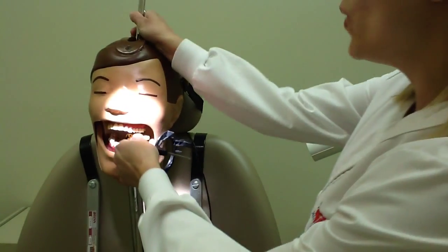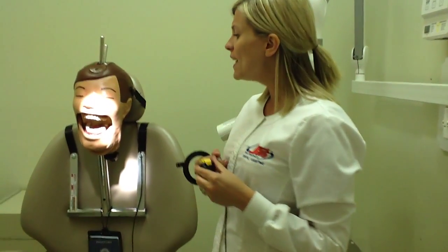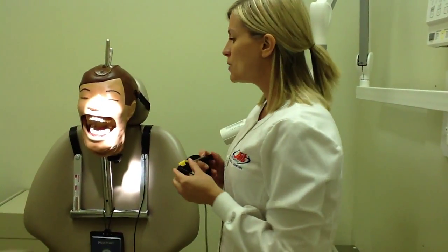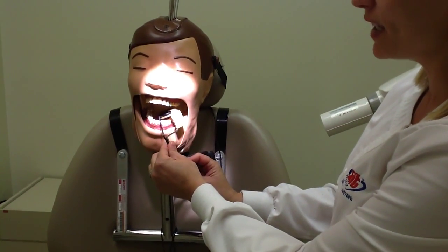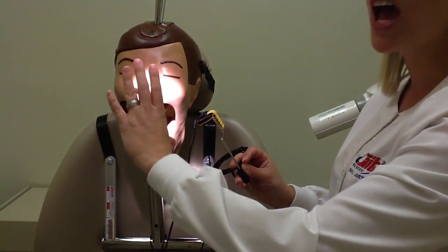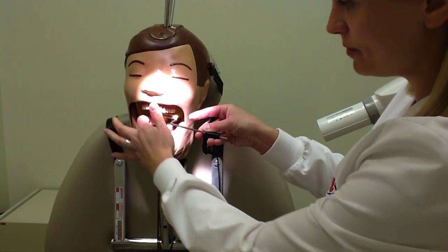One thing I want to mention too, PAs in general can be a little bit uncomfortable. So we have a rule called the TPR, and that helps with the success of your exposure and the comfort for the patient. T stands for tilt. Not sure if you noticed, but when I was entering with the sensor, the receptor, any type of receptor, you want to angle it in. You don't want to jam it in, and you don't want your patient to have to open as wide as possible. Some patients cannot open that wide, so you have to angle it in, and then you'll position it.